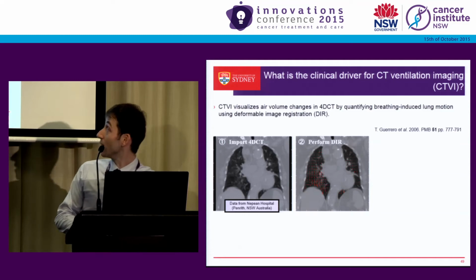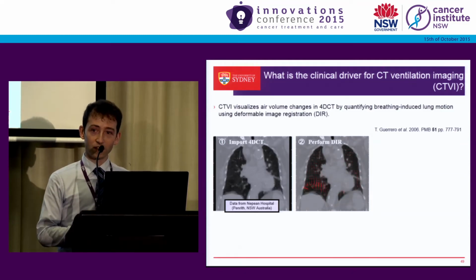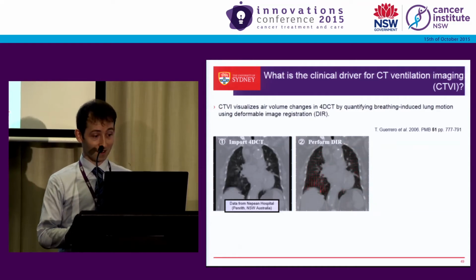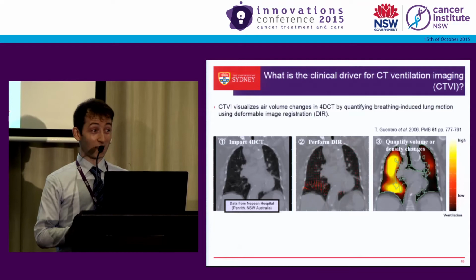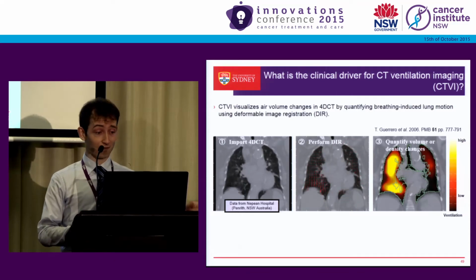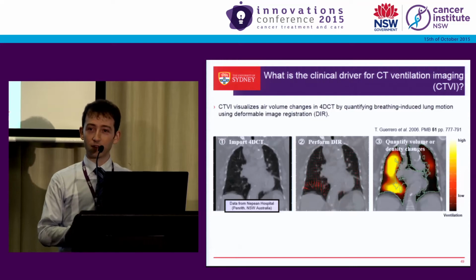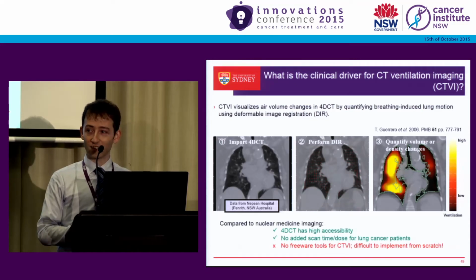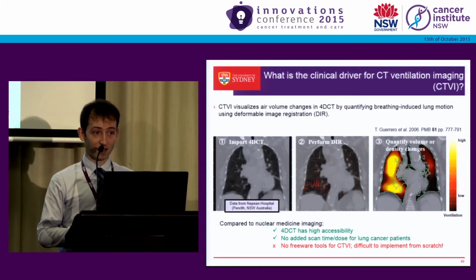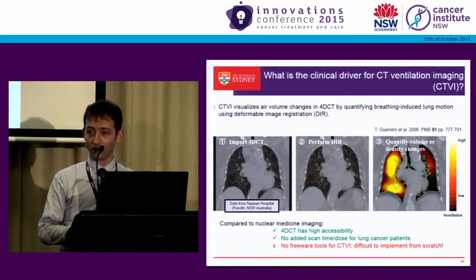So it works in 3 steps. From our 4D CT, we quantify the motion of every lung tissue element in the image, like so, and quantify the amount of regional contraction or expansion, as well as density changes due to breathing, which are both surrogates for function.